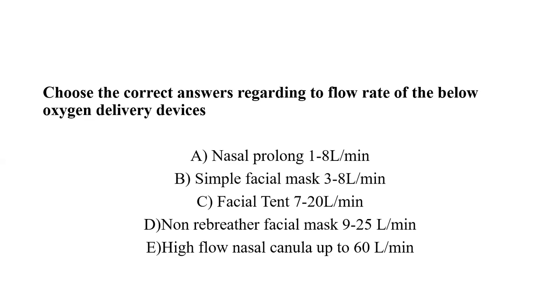Facial tent, 7 to 20 liters. False. Non-rebreather facial mask, 9 to 25 liters. False. High flow nasal cannula, up to 60 liters. True.